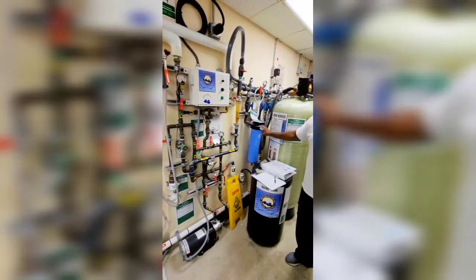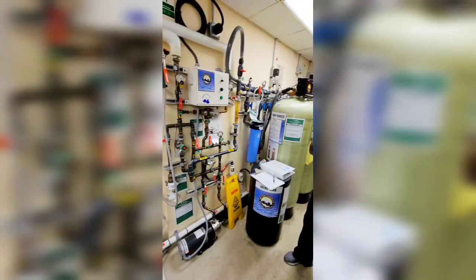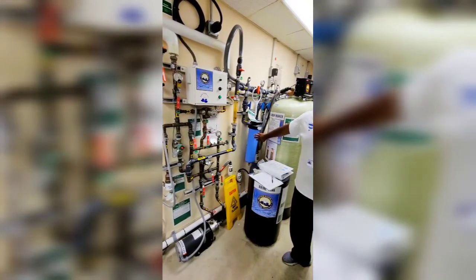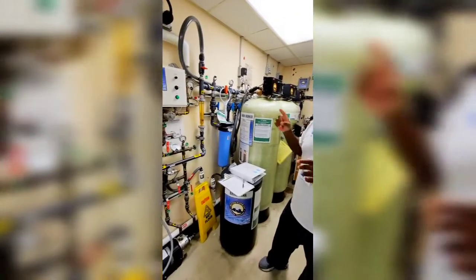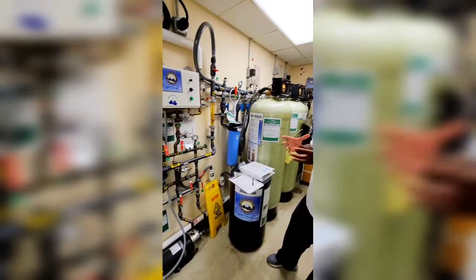This sediment filter just gets out any kind of particles in the water. This is the dirtiest filter we'll have because it's the first one coming from the city. I change all these filters out once a month, but that one — because it's the first one — it's the only one that really turns dark.